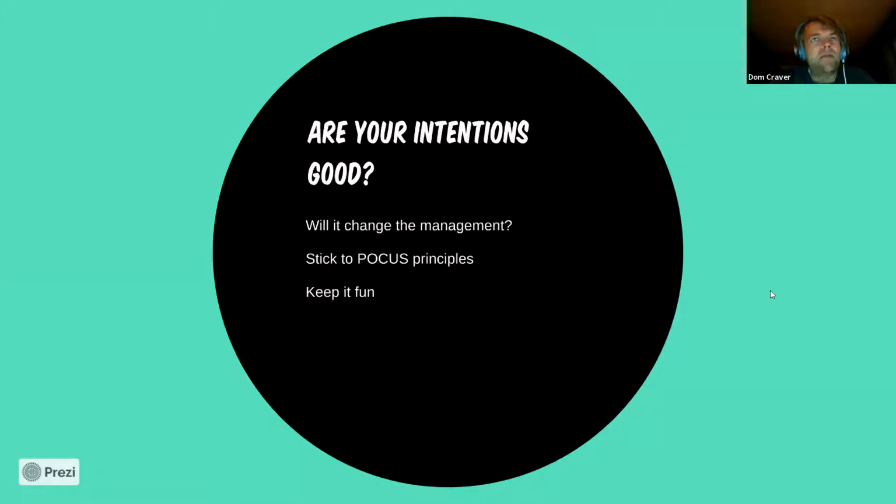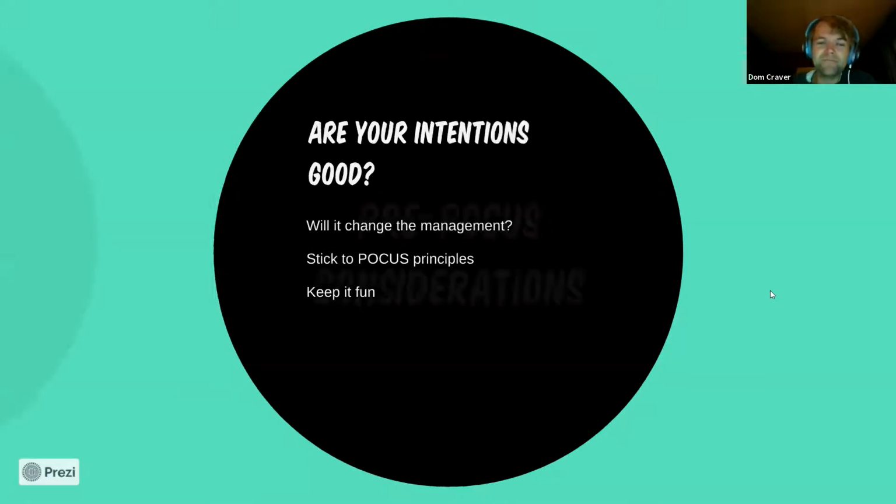And with any point of care, we've got to think about our principles. So just ask yourself what you're looking for. Determine your question before you start the scan, and think about things like the pretest probability. And also think about, could it possibly change the management? Usually yes. And we're dealing with children, so keep it fun. Kids love to get involved with looking at the screen. A bit of colour Doppler always goes a long way.